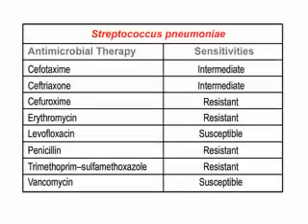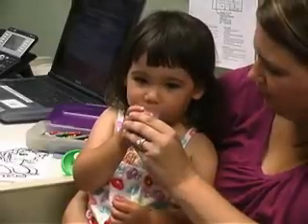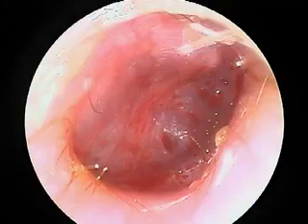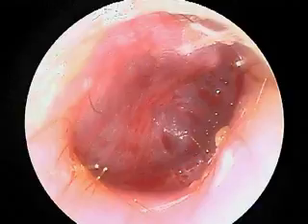Gram staining of the middle ear specimen, as well as the susceptibility pattern of the organisms isolated, should be used to guide antimicrobial therapy. The small tympanic membrane perforation made during tympanocentesis usually heals in approximately 2 to 3 days, and some serosanguinous drainage during this period is normal.